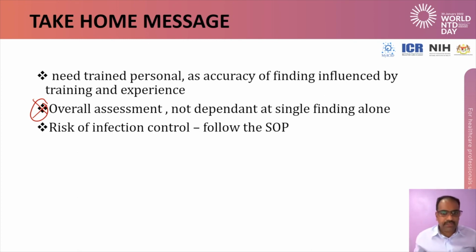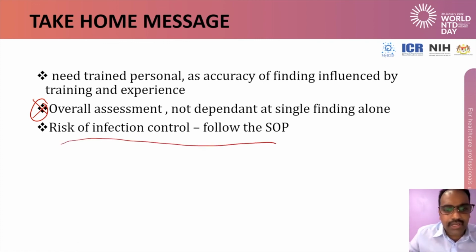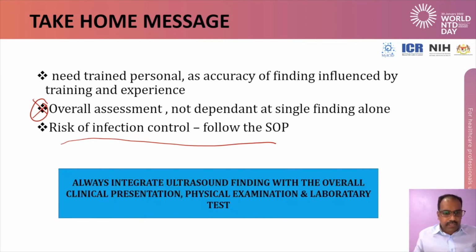Another most important thing in this current pandemic is risk of infection control. As I presented in my first one or two slides, follow the proper SOP on cleaning these equipments. Ultrasound should always be integrated with the overall clinical presentation, physical findings and laboratory tests.